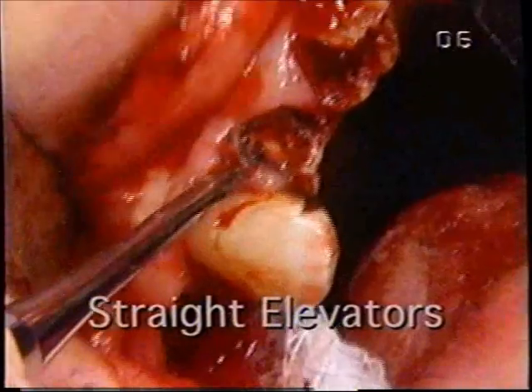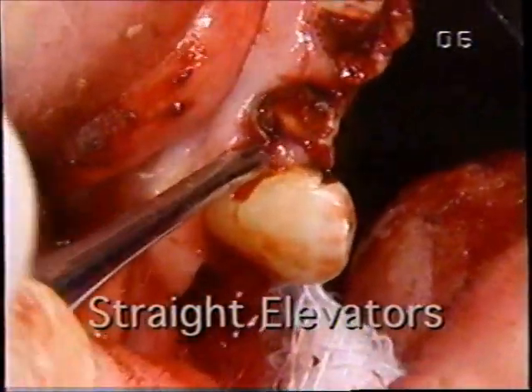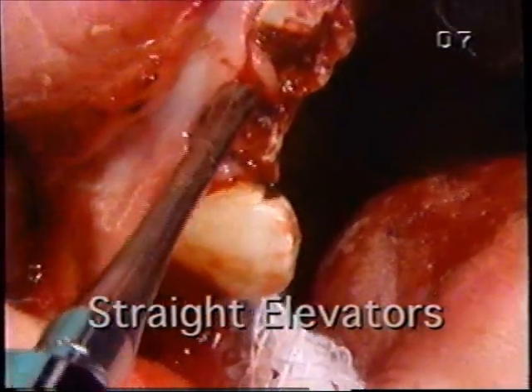Endodontic file. This is a method I don't use very often, but occasionally I use a 30-35 file in a root tip that may be somewhat loose to help facilitate removal. Straight elevators are the workhorses of exodontia. They're the pre-luxators. They luxate prior to luxating a little more, perhaps, with a forceps.